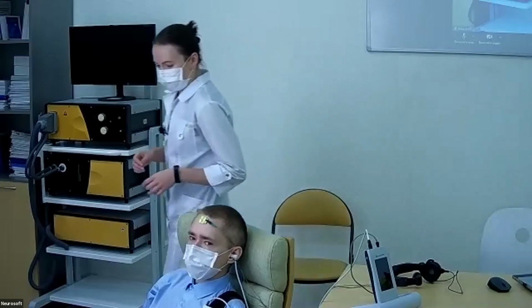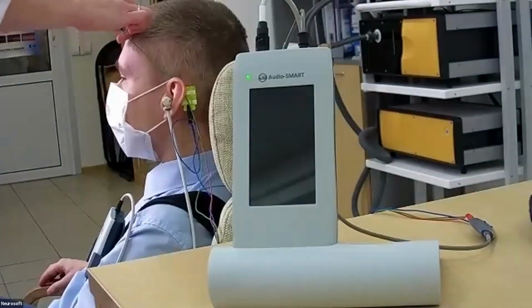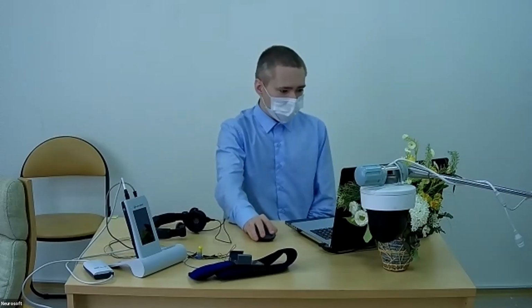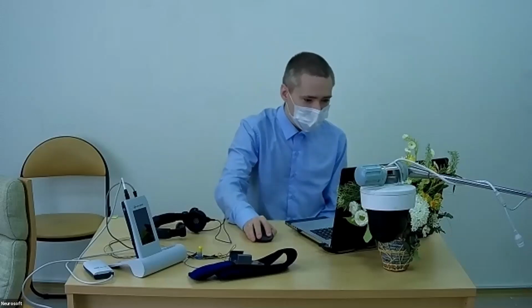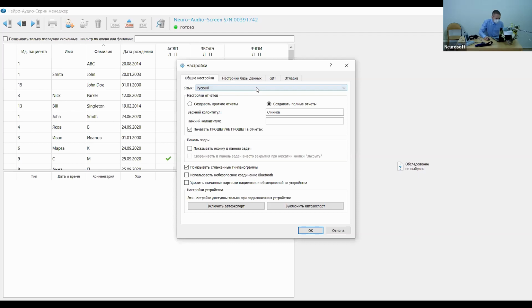So I think I can release Michael. Thank you, Maya. And now I will finish my presentation showing the Neuro Audio Screen Manager software. So I will share my screen again to show you the software. Sorry, I will switch to English.